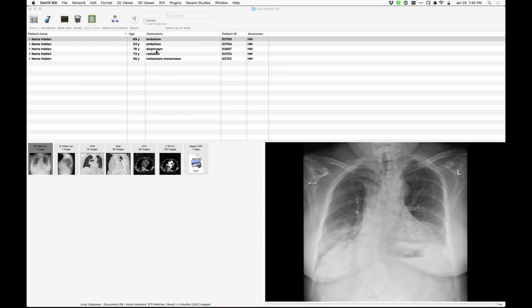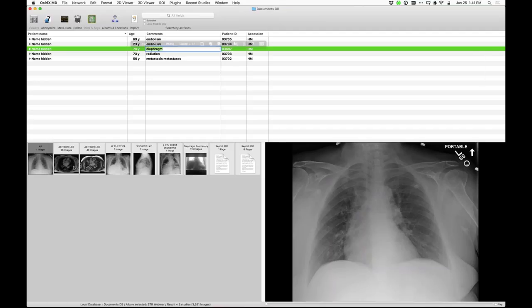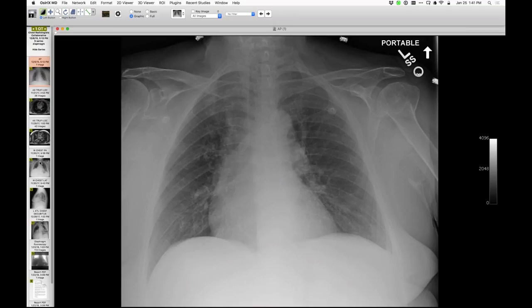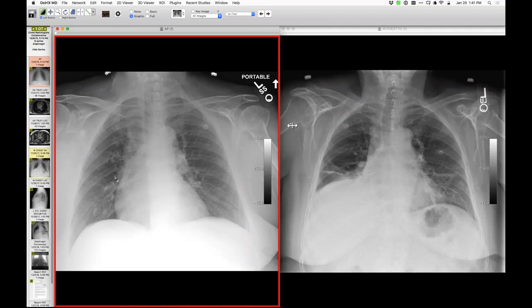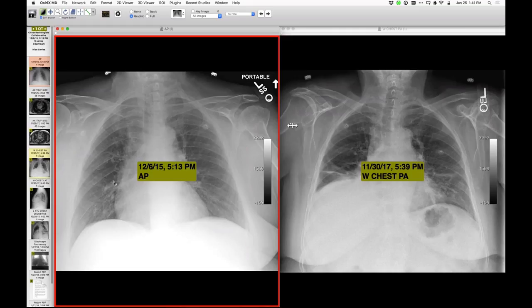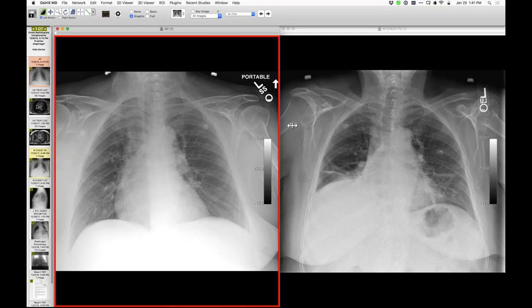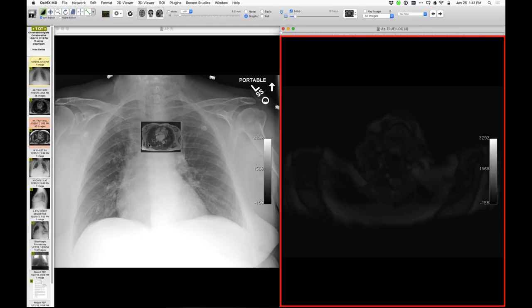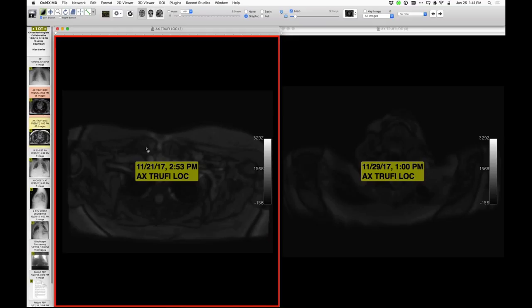Showing two images of the chest — the time between them is eight days. There's a new finding on the MRI of the heart: abnormality in the right hemithorax. There is a little pleural fluid, the diaphragm is elevated, and there is opacity consistent with atelectasis — a new finding between the two exams.